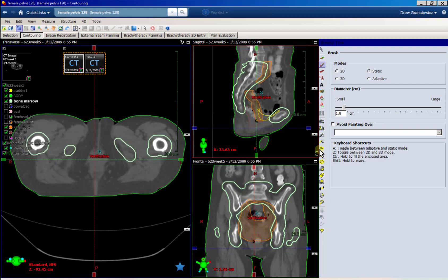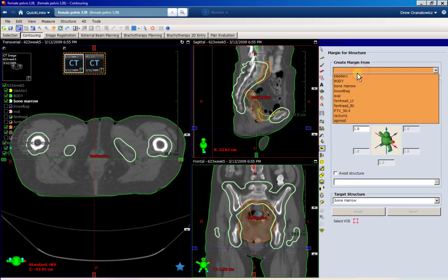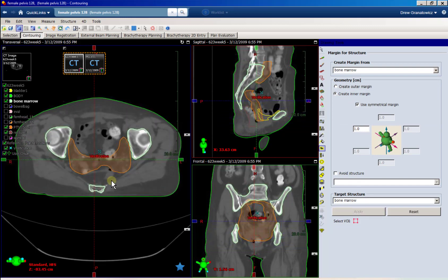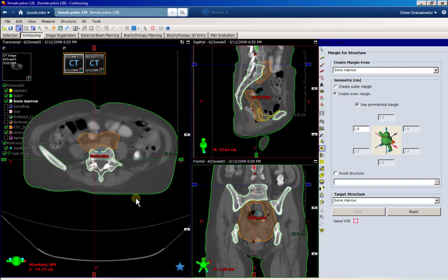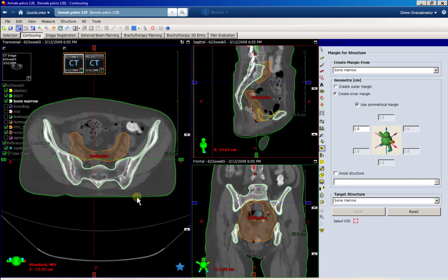That's pretty good. Now if we come back to the margin tool, I'm going to create an inner margin — same one centimeter — and click apply. This expands inside, undoing that outer margin. Now look, all those holes are gone. We have a very nice, continuous contour that looks very similar to how econtour has it.